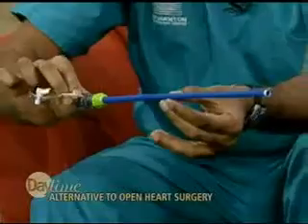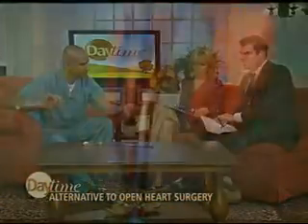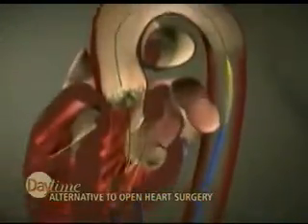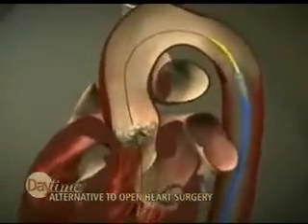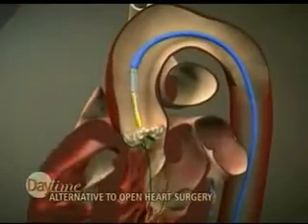So here it is. This is kind of intimidating looking. What do you do with this? Well, this is actually the valve itself. So the main thing is, first, before we introduce this, we use a catheter to be placed in the femoral artery of the groin. This catheter goes through a sheath, and after that's done, this valve itself is deployed on this catheter all the way through the sheath into the heart itself, and the valves themselves are right here. And this is initially crimped on the balloon.